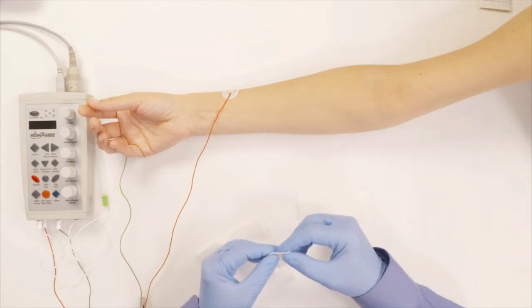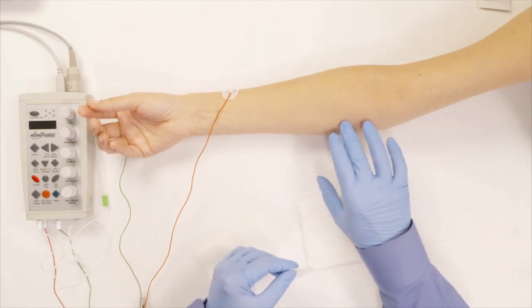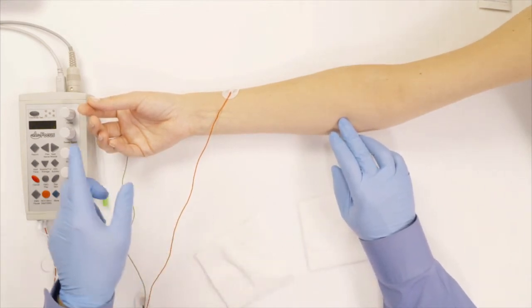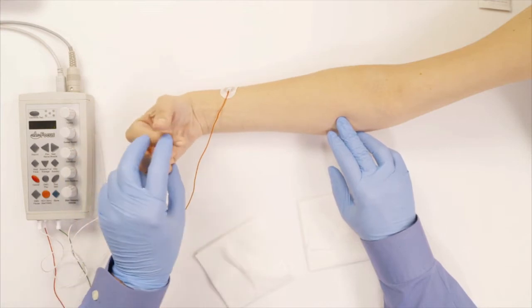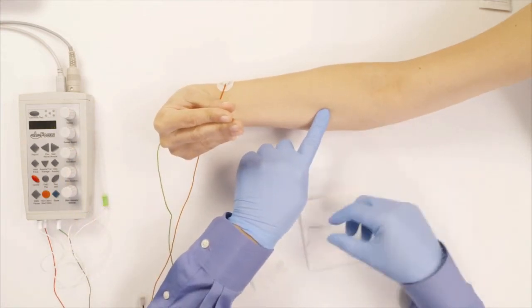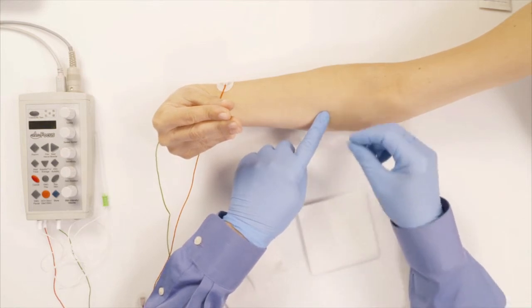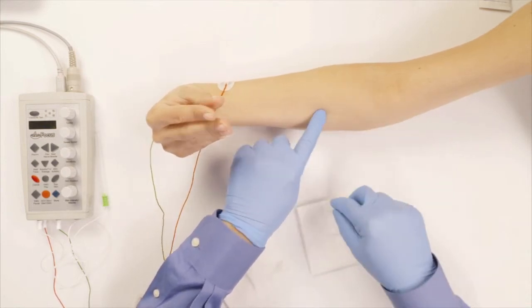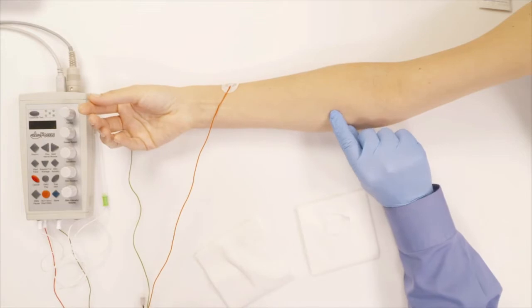The next muscle is the flexor carpi radialis. It's usually right here. In order to activate it I ask her to point your fingers to her elbow. As soon as she does that, I know where that muscle is. I can feel it because it's tightening up. Now relax. I know that the next place I'm gonna stick the muscle is gonna be right here.